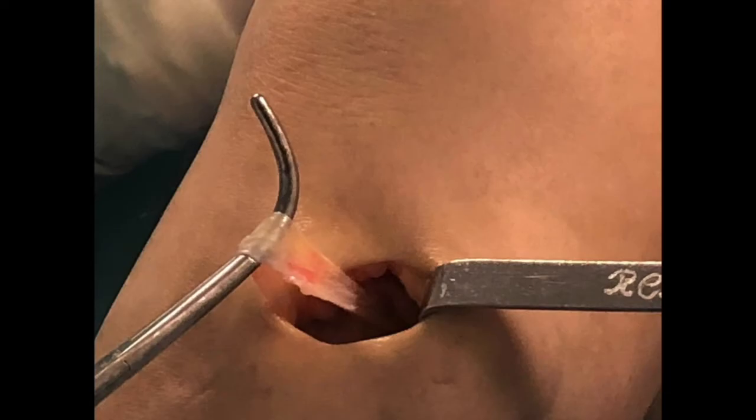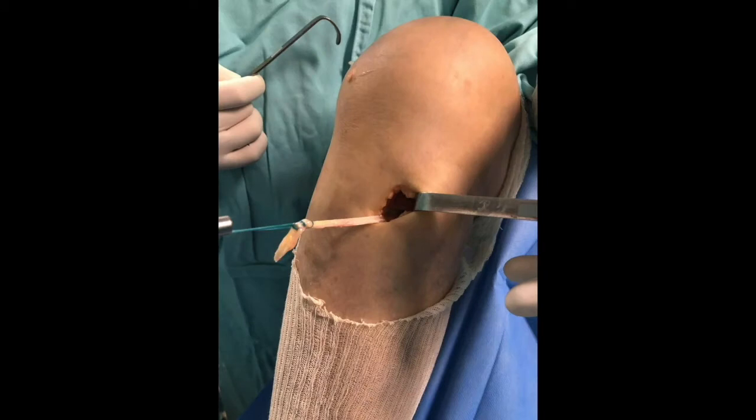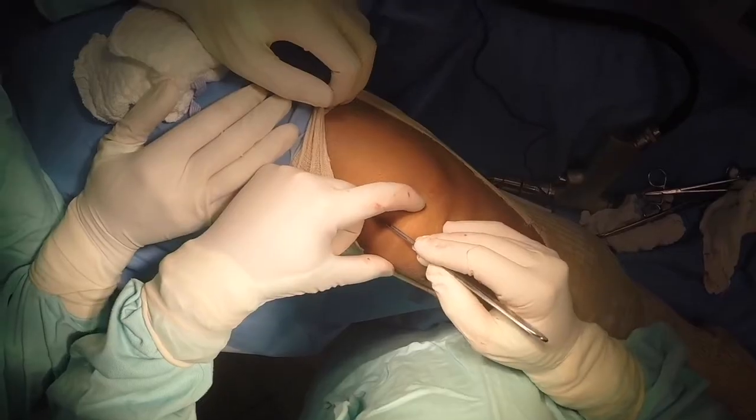Next, the semitendinosus tendon is harvested in a standard manner. The medial border of the patella is then exposed via the previously marked incision, taking care to leave the capsule intact.